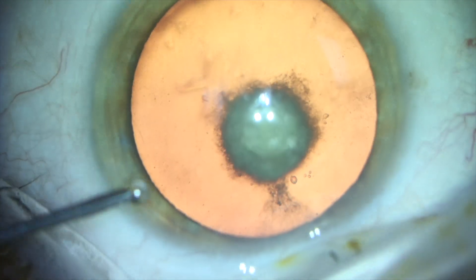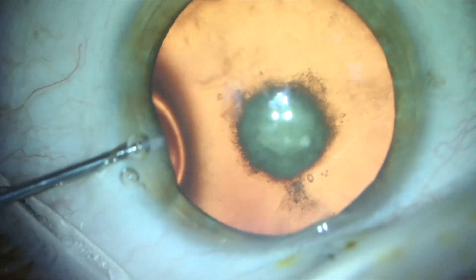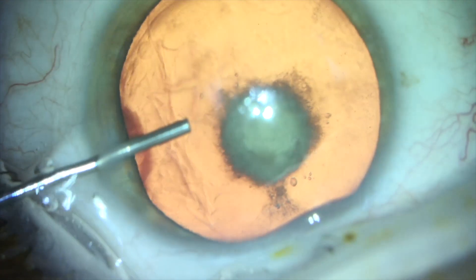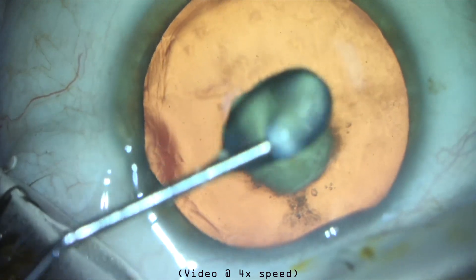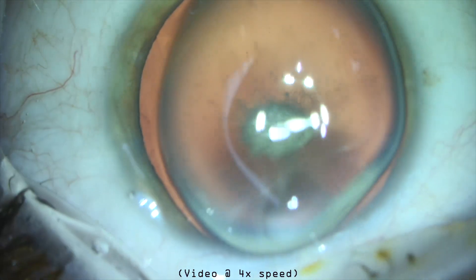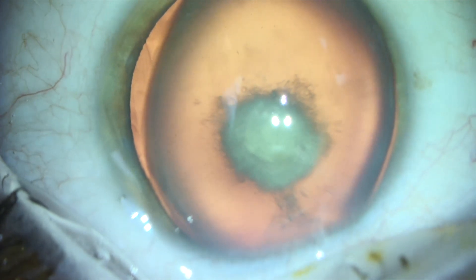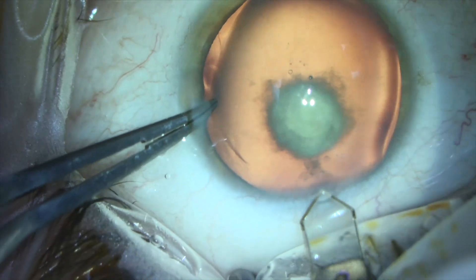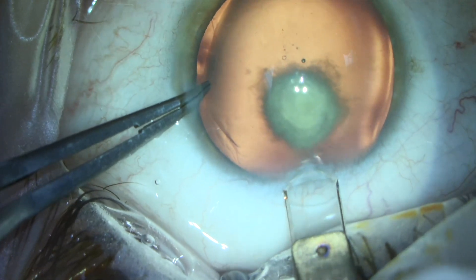If the posterior capsule ruptures during surgery, then the patient may need to have a vitrectomy and subsequent surgery to remove the cataract and place the desired lens implant. So what tricks will we use to safely navigate cataract surgery in the presence of a posterior polar cataract? We need to prevent and ideally avoid complications.